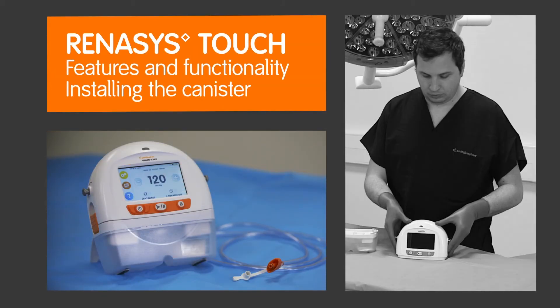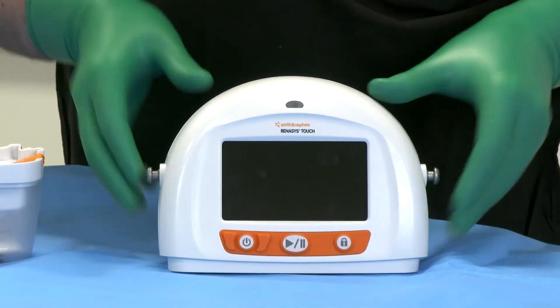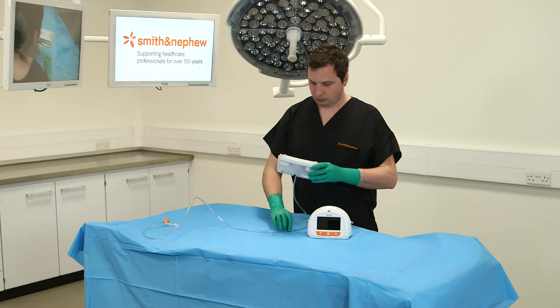Installing the canister. Ensure that therapy is paused or the device is turned off. Remove the paper tape around the canister tubing and release the tubing to its full length.